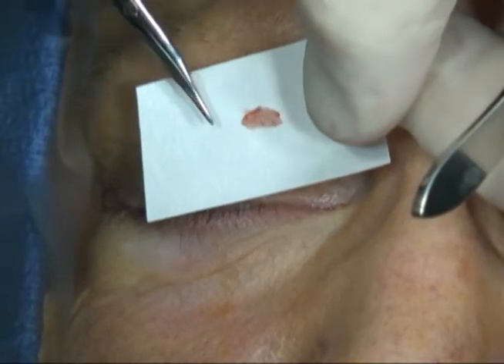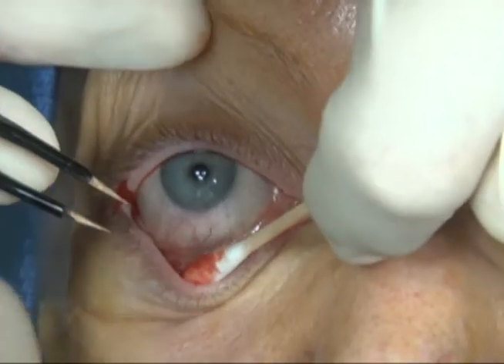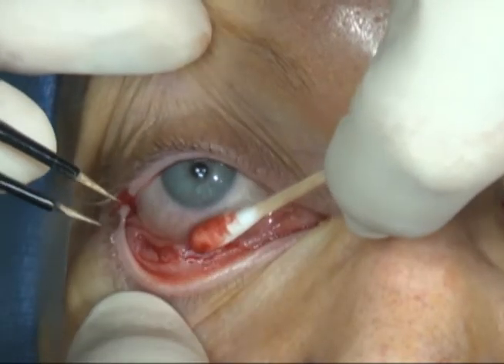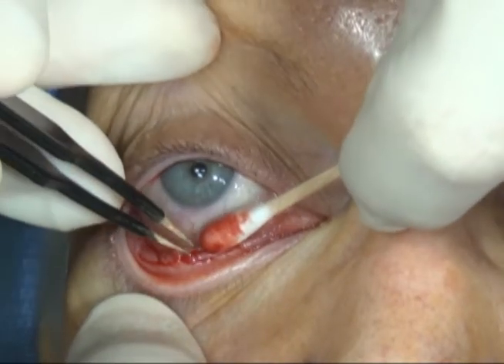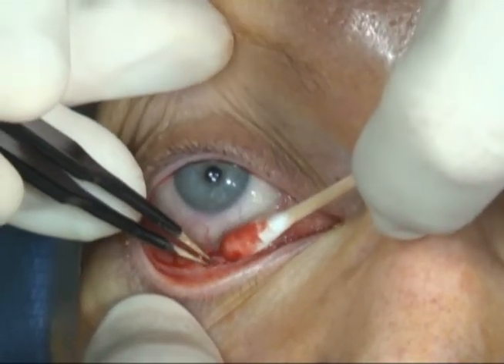Hemostasis is obtained with a bipolar cautery. These sites do not need to be closed with suture. Antibiotic ointment is used three times per day.